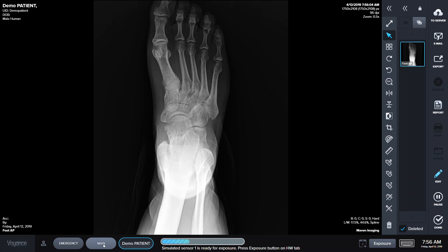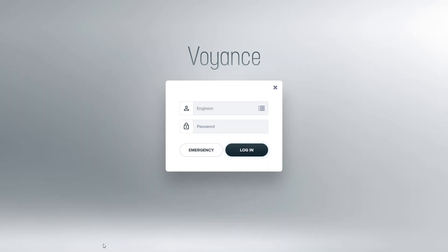Once completed, we can click on Main, and it takes us back to our login screen for the next time we need to use the system. This is Maven Imaging. Thank you for your time.